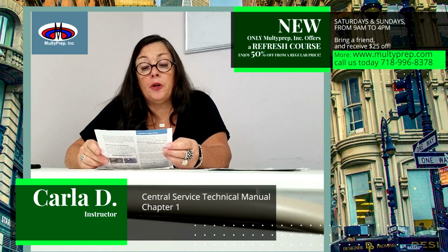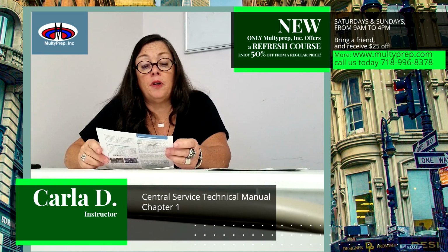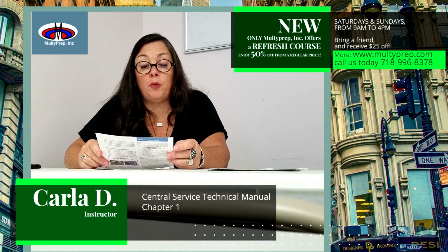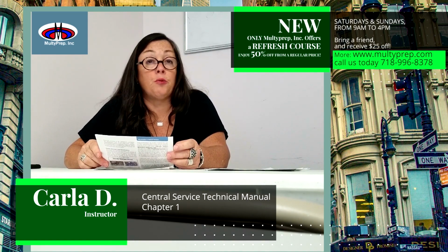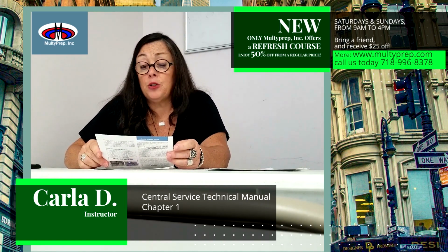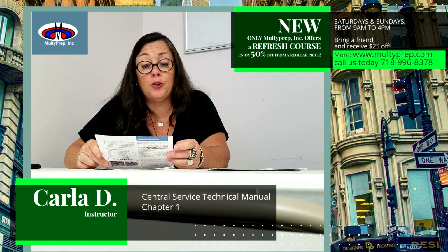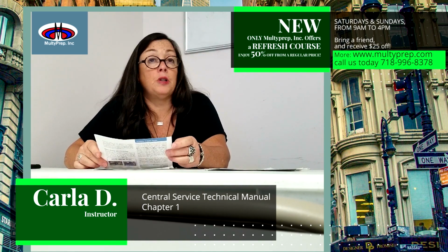All CS areas must exercise careful environmental control conditions. Each work area should be restricted to assigned and authorized personnel who consistently follow the facility's dress code policies. Strict traffic control patterns must control the movement of people and goods through the department. Air pressure levels must be maintained to control air movements. Proper air pressure control helps to prevent the flow of bacteria-laden particles and dust from the soil to the clean areas.